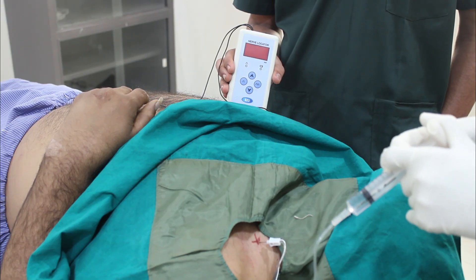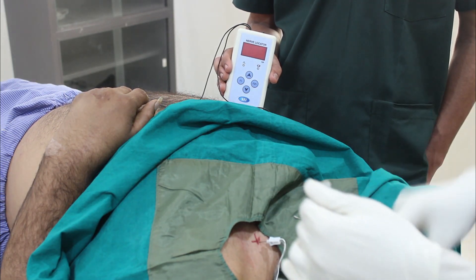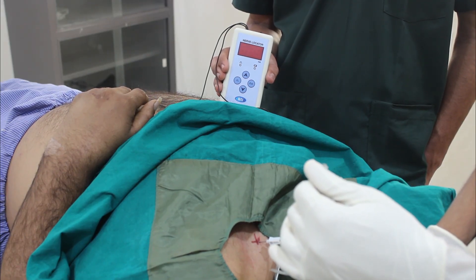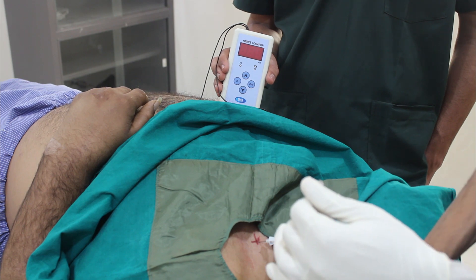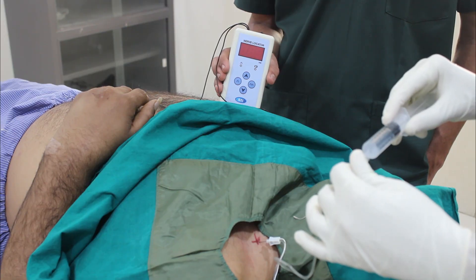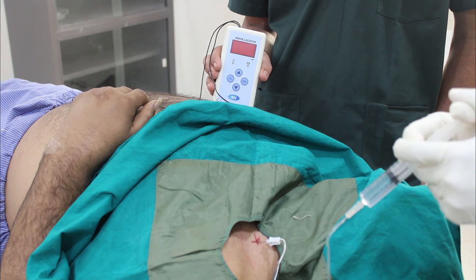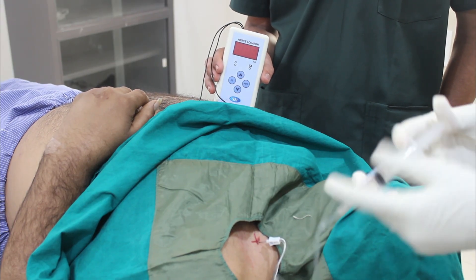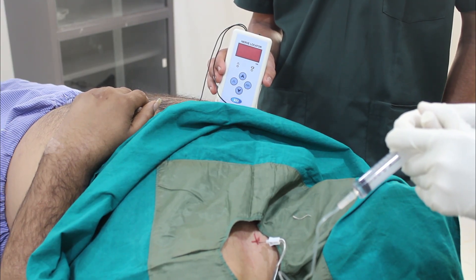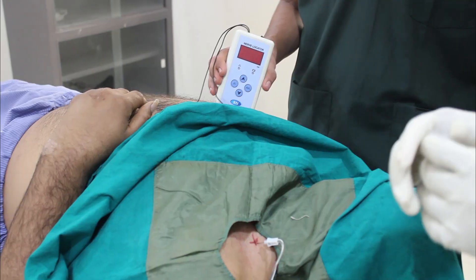Supraclavicular brachial plexus block is the most popular and most useful block for upper limb surgery, because it will block the entire upper limb except the shoulder joint. So it will be useful for the majority of upper limb surgeries below the shoulder joint. Aspiration every 3–5 cc is very important to avoid inadvertent intravascular injection of the local anesthetic solution. I have done the supraclavicular brachial plexus block.